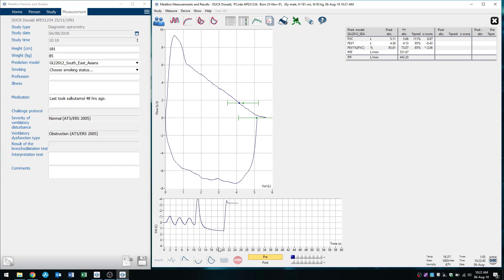So once again, to start the test, we want to press on this flow volume loop. And when we're done, we're going to press stop.